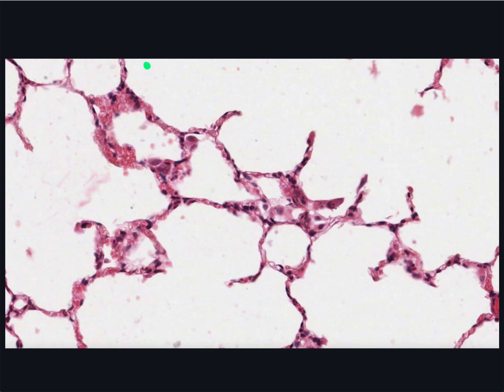Follow an alveolar duct along here and appreciate that the alveoli themselves are not parts of the walls of the ducts, but outpocketings from the walls, as you saw on the model. The wall itself is composed of little more than minimal bands of smooth muscle overlain by an almost invisible squamous epithelium. Here, the wall shows only a single smooth muscle cell cut transversely as a small bulge at the end of an alveolar wall.